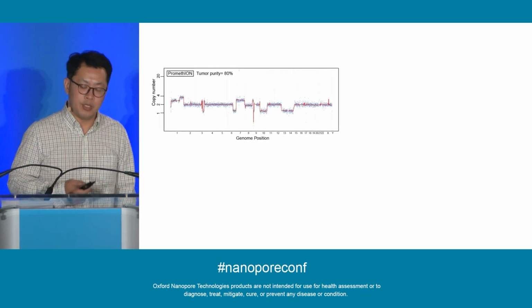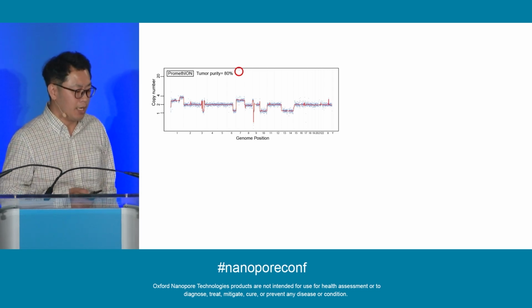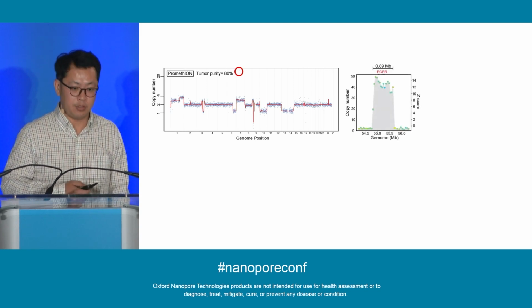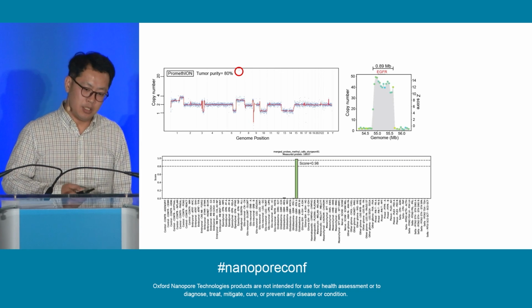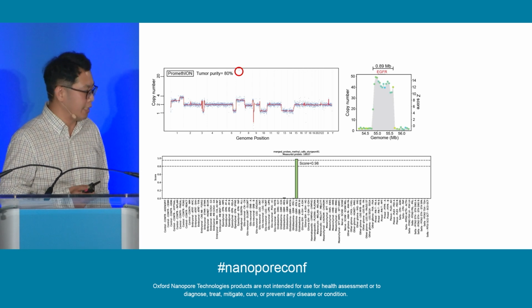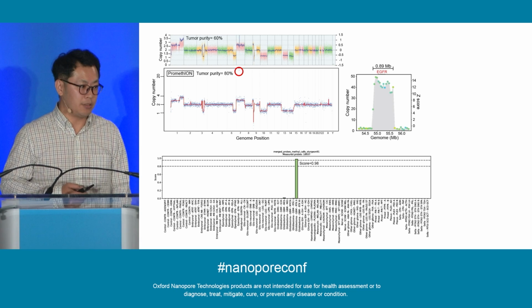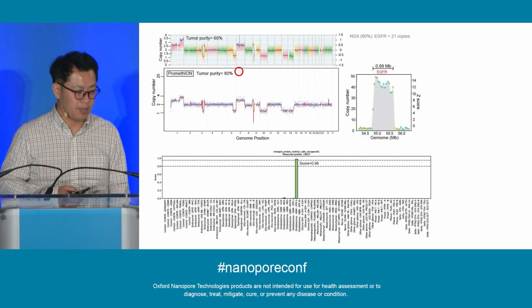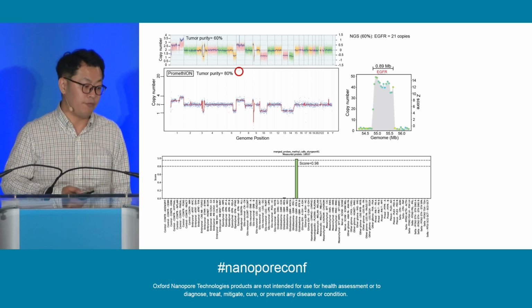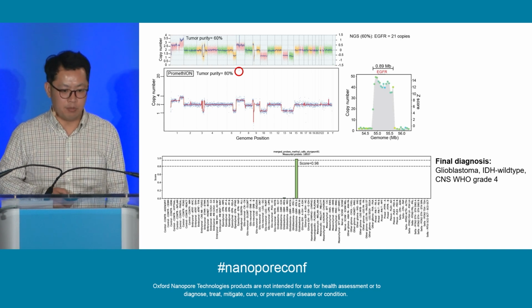That's it. Intraoperatively, we'll say that this is a high-grade glioma. But we extracted the tumor DNA and ran our assay, and we got this characteristic +7/-10 alteration and also the EGFR amplification in this sample. The methylation classification accurately classified it as glioblastoma with a high calibrated score. We waited 2 weeks, and the OncoScan result came out consistent with what we saw here. Another week later, the next-gen sequencing result came out with this EGFR amplification. But we already knew that 2 weeks before, and this is already a glioblastoma.